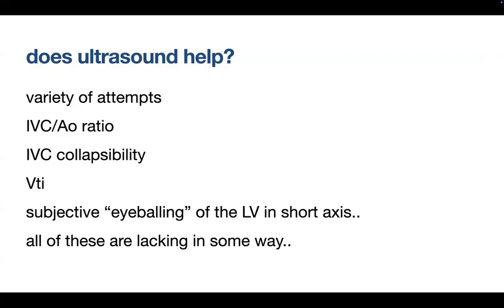So what I tend to teach is basically you're looking at the IVC in the clinical context. Like the example of the patient I just had, if that patient had a very flat IVC, you're like, oh, okay, they probably could do with some fluid. In the case that I showed you, that IVC was quite distended. Again, there's lots of caveats, the PEEP, whether or not the kid's spontaneously breathing, et cetera. So I think if you look at the IVC in the extremes, you get a better idea, as opposed to trying to look for numbers in terms of 50% collapsibility. Don't think it's useful. I think you have to just look at it as another vital sign, per se, when you're trying to make the assessment of what this kid needs to fix their physiology.